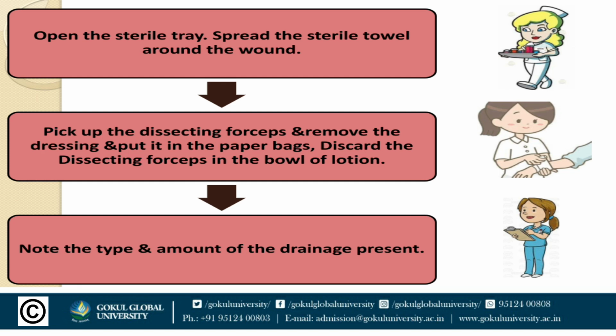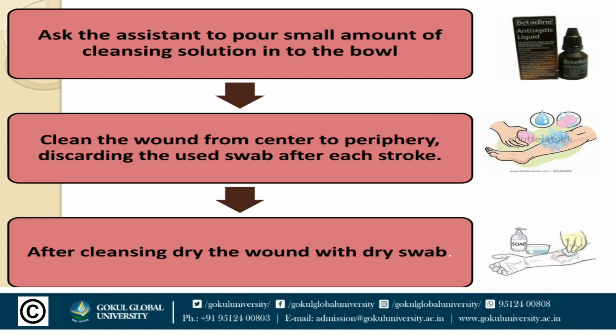After spreading the sterile towel, pick up the dissecting forceps and remove the old dressing. After that, discard the dissecting forceps in the bowl of lotion to prevent infection. Whenever you remove the old dressing, note the type and amount of the drainage present. It will help to prevent further infections.